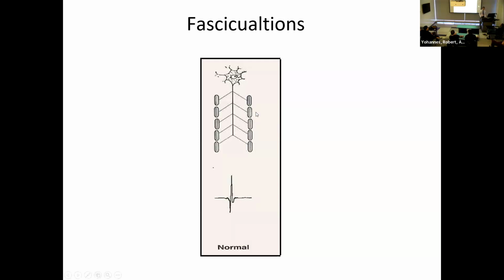Now, they may have different shapes because this abnormal activation can happen from the nerve, or it can happen anywhere along the nerve and then spread. Also, this can happen in metabolic situations, and the metabolic trigger can happen anywhere along the nerve. So each one of the bursts can look different. Now they have this very low frequency sound. In this case, listen to popcorn. Okay, popcorn. That's what we're looking at.